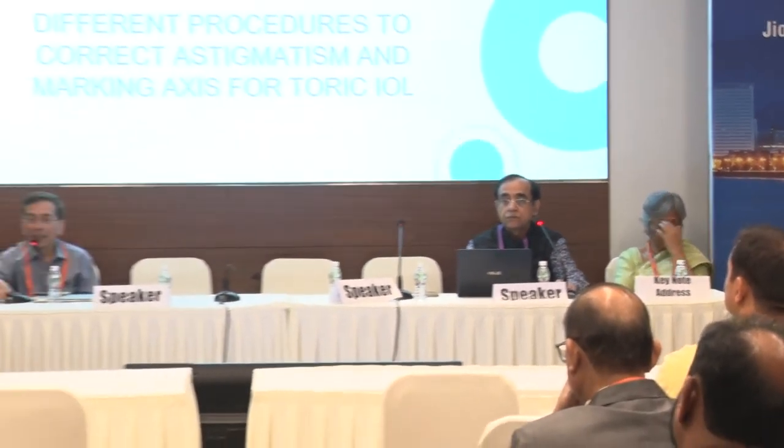Yeah. Probably if the patient is emmetropic and your topography is showing astigmatism, then you should definitely consider the topography, because this astigmatism might have been balanced by the lenticular astigmatism. Sir, topography usually gives the same K values. It takes an average and it gives the same K.